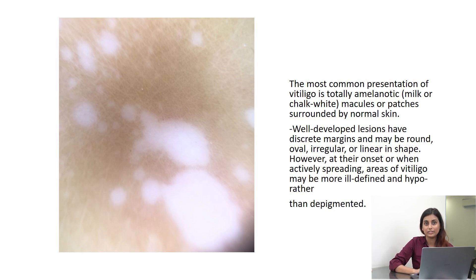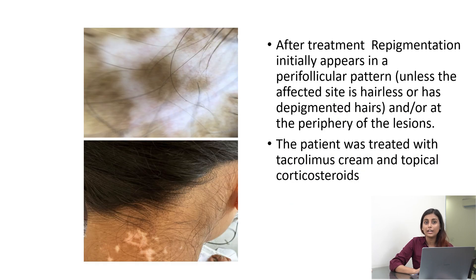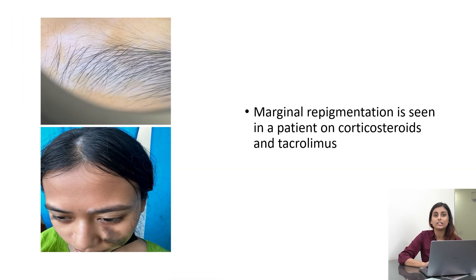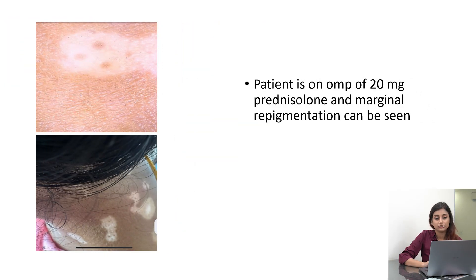If we give a vitiligo patient some treatment, there will be repigmentation in the vitiligo patch, and that repigmentation tends to occur in a particular fashion. For example, you can see in this figure that this patient who was given tacrolimus and corticosteroids had repigmentation around the perifollicular area to begin with. You can also have pigmentation at the margins of the lesions — this patient was on prednisolone and we can see some marginal repigmentation here as well.